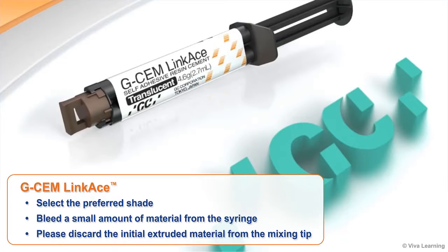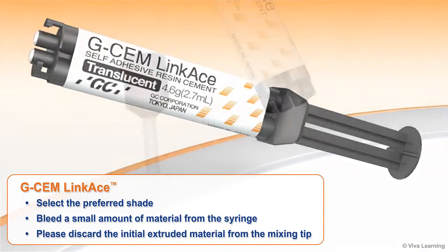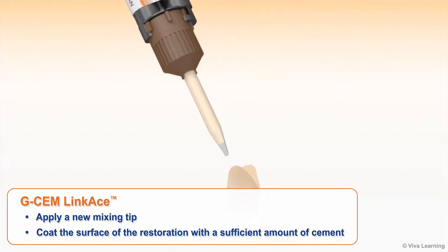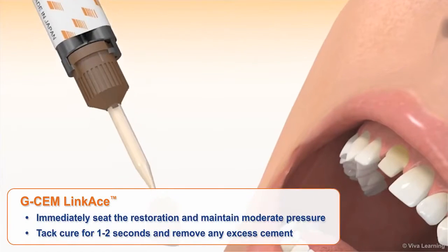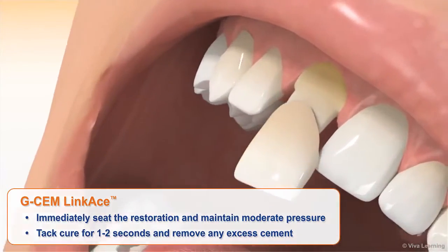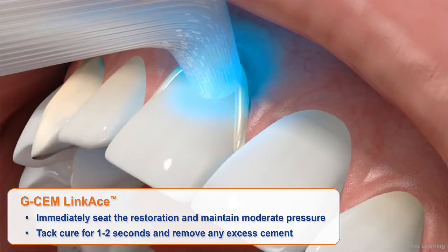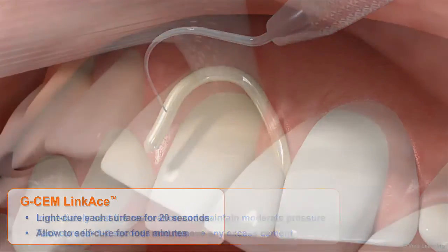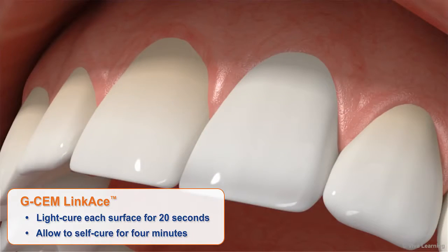GCem LinkAce is easy to use and ultra-convenient. Select the preferred shade and bleed a small amount of material from the syringe. Apply a new mixing tip and coat the surface of the restoration with a sufficient amount of cement. Immediately seat the restoration and maintain moderate pressure. Tack cure for 1-2 seconds and remove any excess cement. Then light cure each surface for 20 seconds and allow to self-cure for 4 minutes.